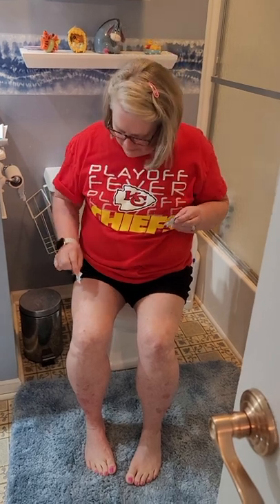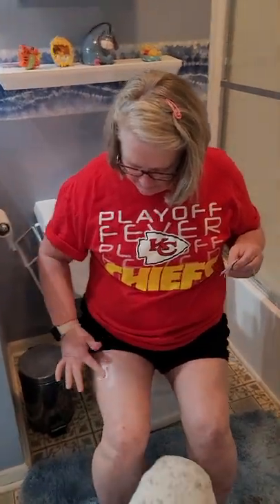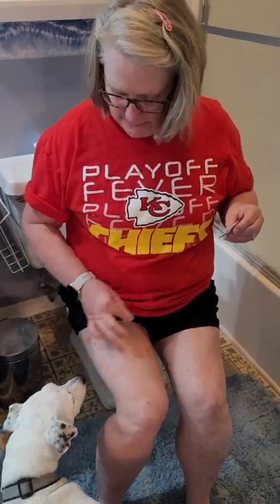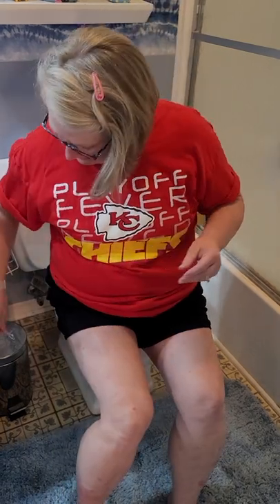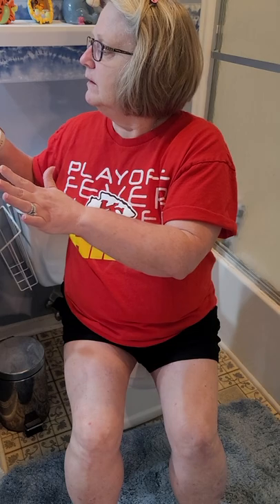So we have that alcohol wipe. Clean my wake really good. Rachel, you're going to have to get out of here. It says to let dry, don't blow. I have my band-aid. I have my water. Now we'll follow instructions.